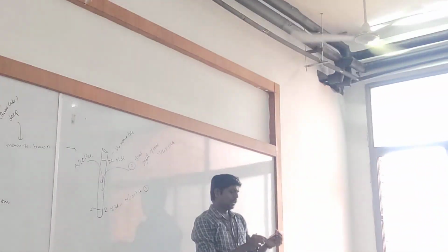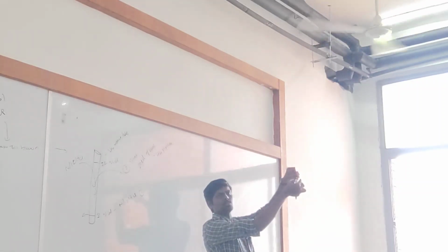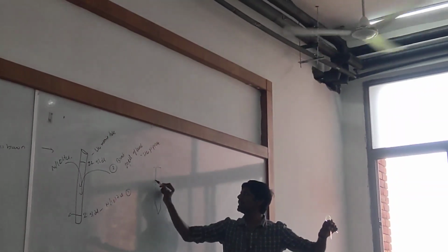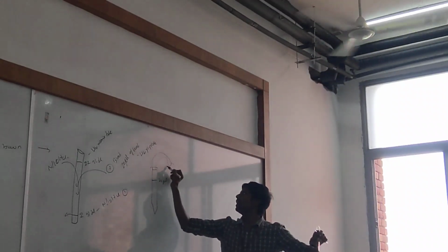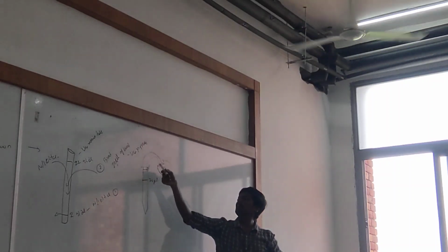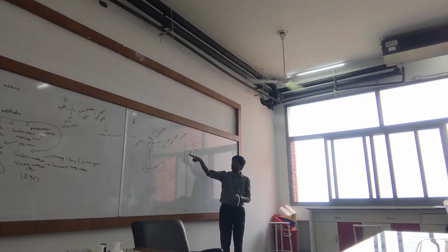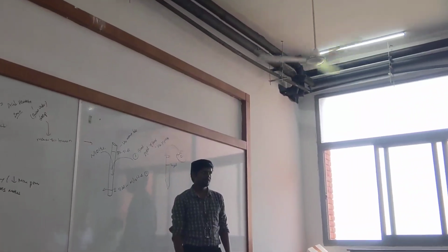Now, this HB pipette has an upper marking of 20 microliters. So what you will do is pipette your blood up to the 20 mark, and you will transfer this blood into the test tube.